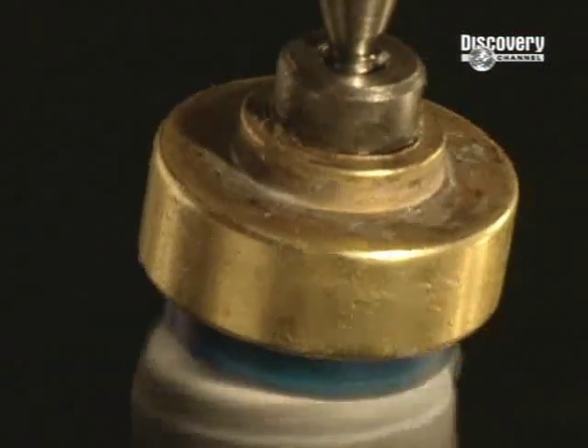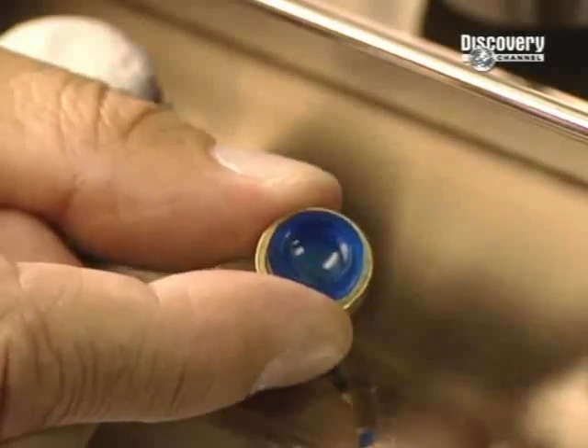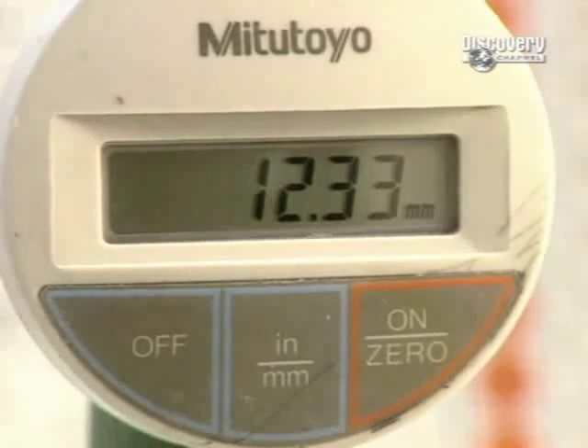The disc must be free from any imperfection and is polished with a super-fine abrasive paste. Polishing is an essential step because it guarantees excellent comfort and perfect vision. A technician measures lens thickness with an extremely precise gauge.